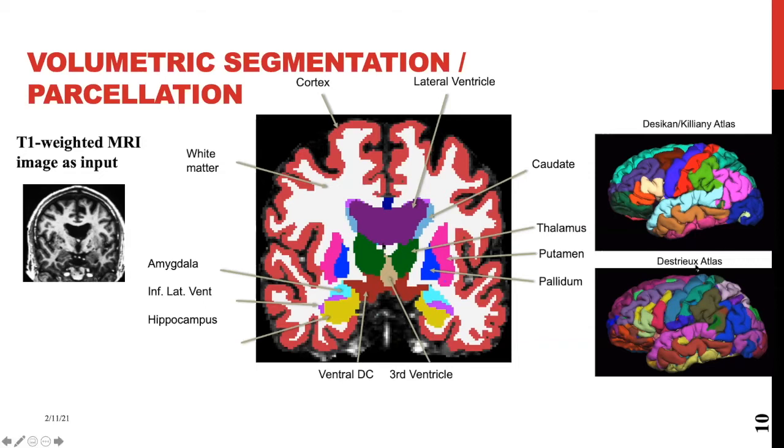And then there's the Destrieux atlas, and these are our collaborators that have worked on this from the very beginning. If you want info on how these atlases were constructed, if you're doing specific analysis on that, or for your papers and citation purposes, that's on our website as well. But that's going to be a little bit important later on in Ren's talk, so she'll probably touch on this again.